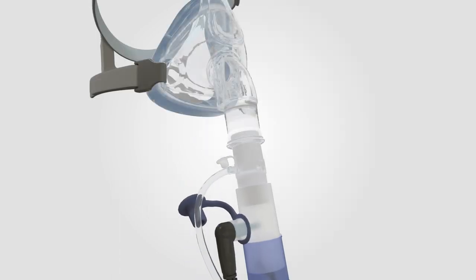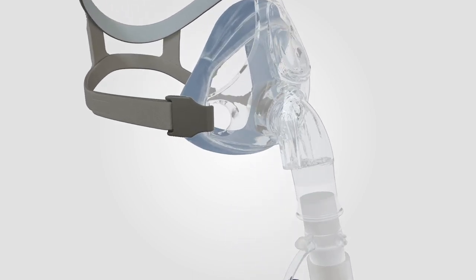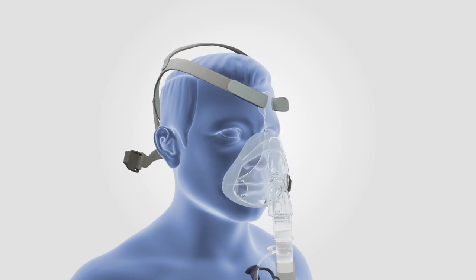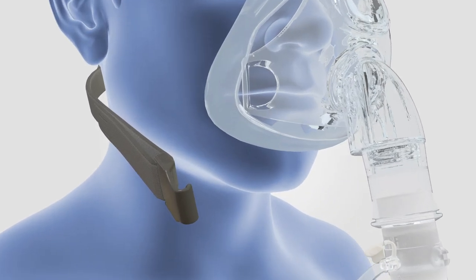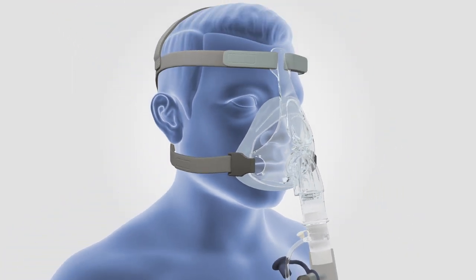Connect the mask to the flow source and ensure the flow source is turned on. Ensure patient monitoring is in place. Undo the gray headgear clip on one side of the mask. Place the seal under the lips and lightly touch the mask to the bridge of the nose. Slide loose headgear over the patient's head and connect the headgear clip onto the mask chassis.